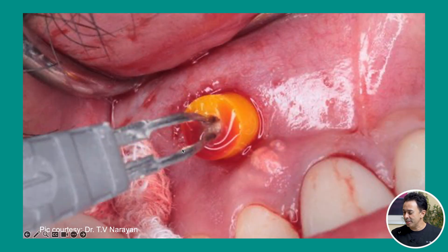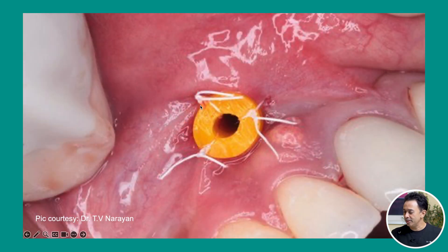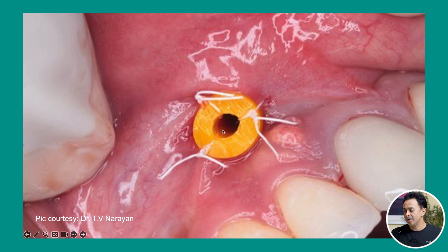The next step is to insert the drain into the opening and suture it to the adjacent soft tissue. Once that's done, you can irrigate through this opening. You can also teach the patient to do this at home, and you can bring the patient back every three to four days if you want to check whether they're irrigating properly — otherwise they can do it by themselves at home.